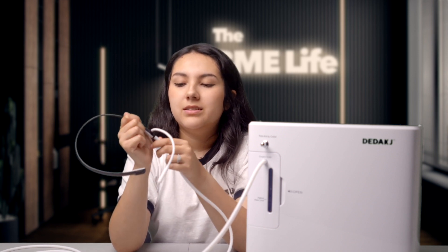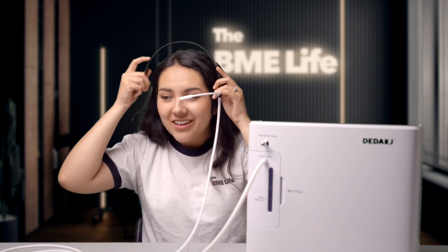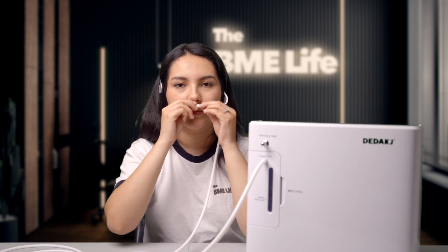In this case, I'm going to be using the headset just because I don't really need oxygen — I'm just trying it out. You can flip it to point the outlet towards your nostrils. And once you're ready to use it, all you have to do is turn it on.